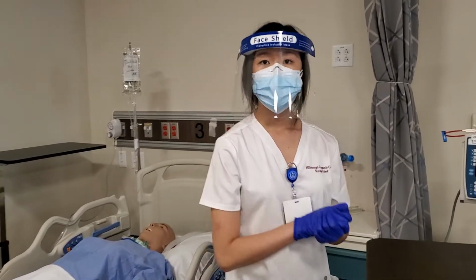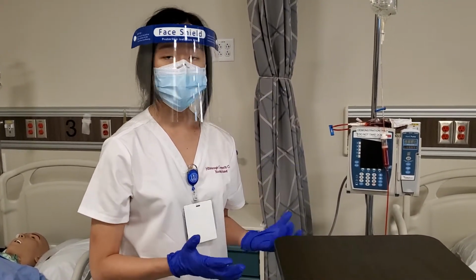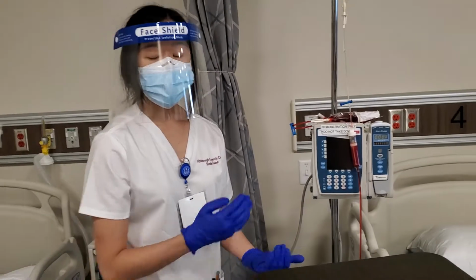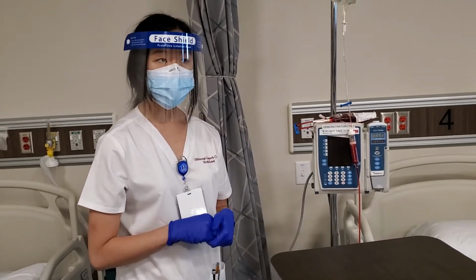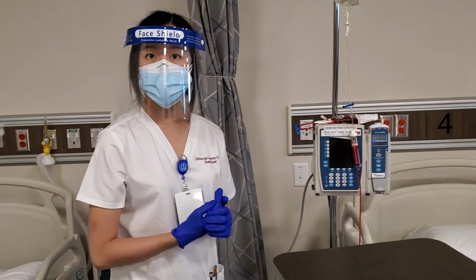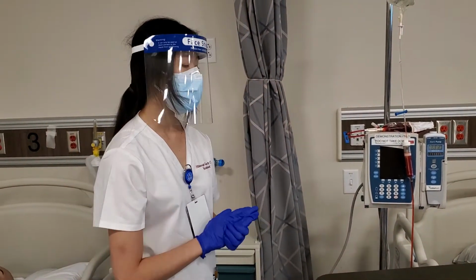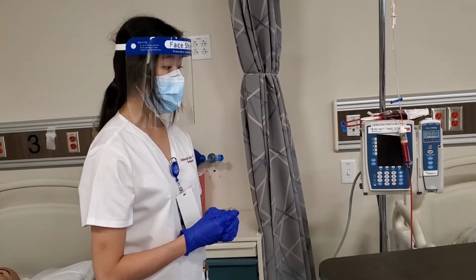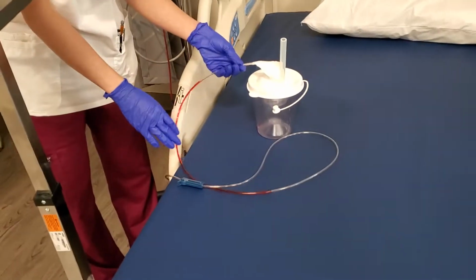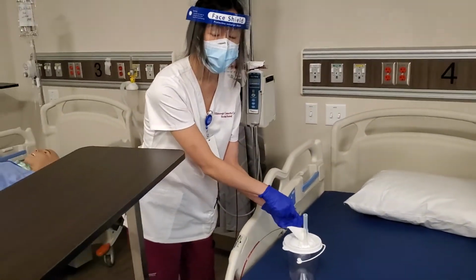And then at the bedside, we're going to need to verify that all the information matches the patient again. So we are going to need to verify the patient's name, birth date, medical record number, once again match the unit number, the expiration date, blood type, and blood product type. Okay? And then now we are going to connect the IV tubing to the patient, maintaining sterility, cleaning the ports if needed, and then attach the saline tubing to the patient.